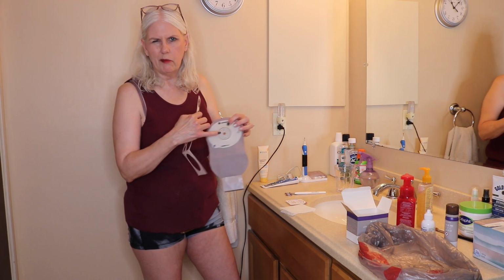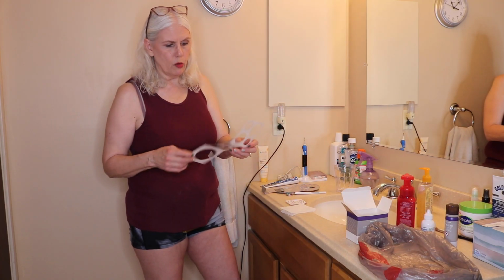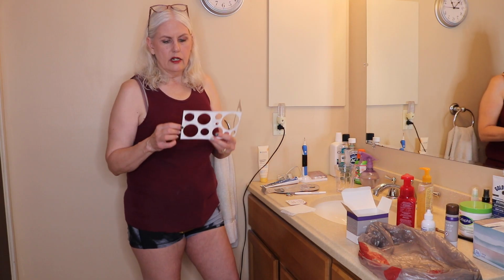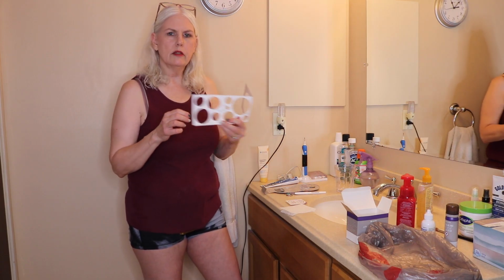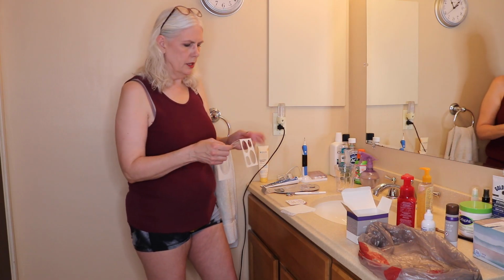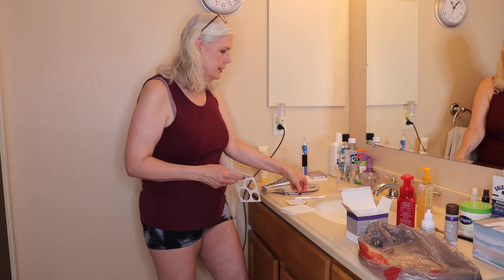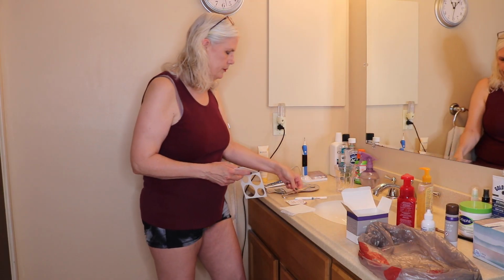So because of that, I cut my own bags. And then I do know what size my stoma is. And so it's just easier for me to lay this on the bag. I draw my circle where I know I want to cut it, and I'm good to go. So then I have my marker and I have my scissors to cut.